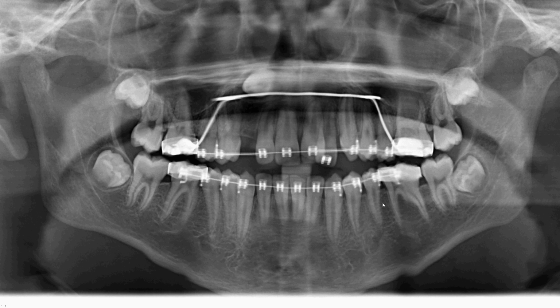Could this be just anatomic morphology? Or could this be a tooth with two separate crowns? Or is this just a very unusual positioning error? Well, to give you a little bit more of a clue or to determine what this is, you have to look at what's occurring to this area.